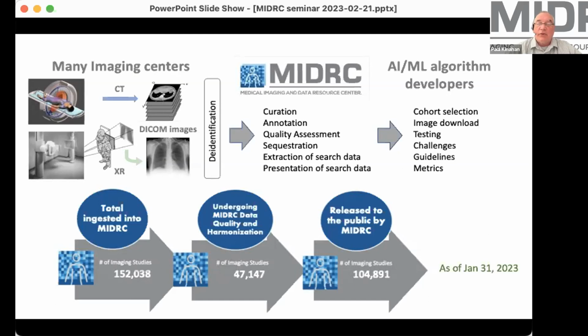Basically, go in and download everything and try to develop methods that are going to generate useful information from the images. There's a lot that has gone into this that you've heard about in other sessions, and I won't go into that. Here, I'm going to focus just on the aspects of curation that relate to the cohort selection. By that, I mean, if there's 105,000 images and you want to start testing things, how do you pick out the images that you want to start working with for whatever algorithm it is that you're developing?